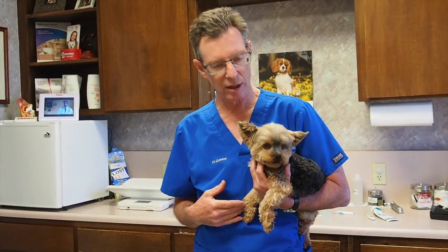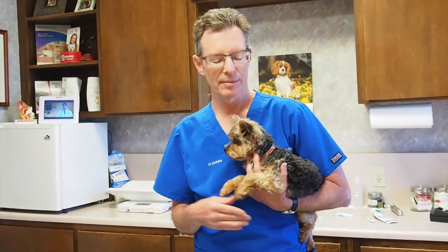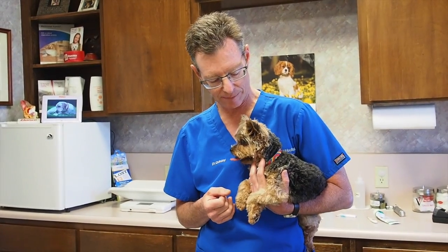But is there any tooth fractures? Is there any abscess teeth that are obvious? Is there any gum or bone recession, which is periodontitis? Are there any loose teeth? How much tartar and gingivitis do we have? So the next step after we do this is we'll determine the grade of dental, try to give you an estimate for that so you can plan on that cost-wise, and then we'll take Jasper in the next step of this video. We'll actually show his dental.